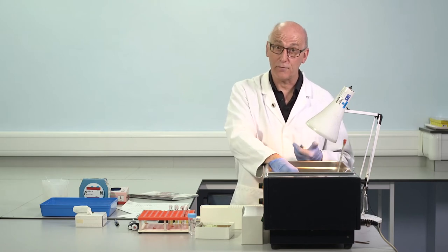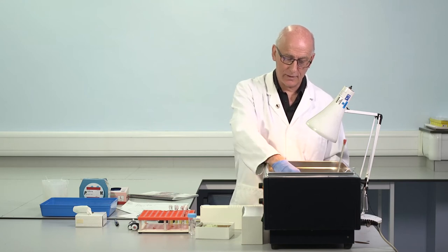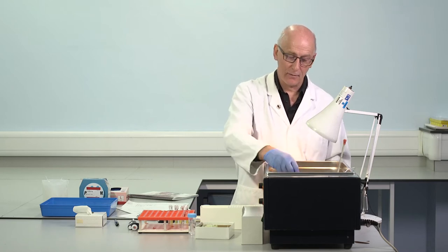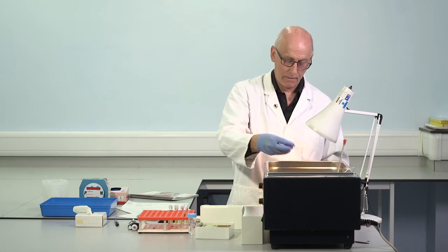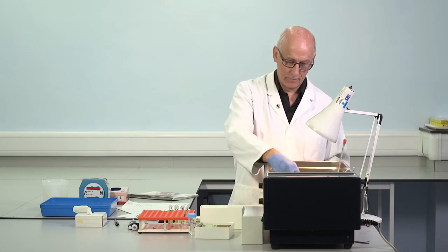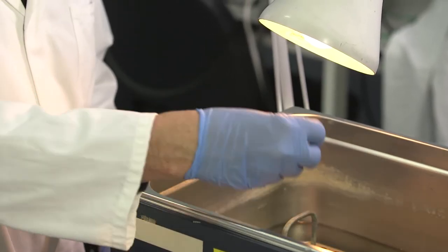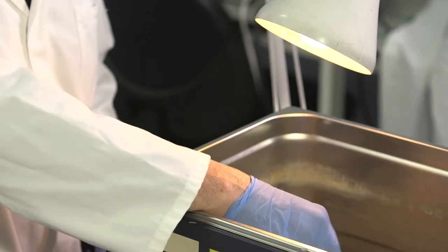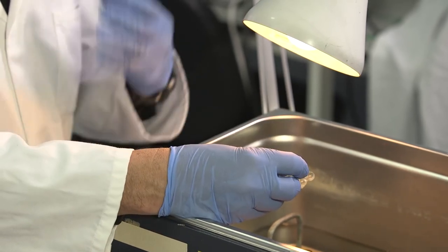prothrombin through to fibrin. So 3 times every 5 seconds through 90 degrees. Balancing the cooling as it's in the air with missing the clot as it forms. So I mentioned that the clot is weaker if the clotting time is longer. The greater the prolongation, the weaker is the endpoint.